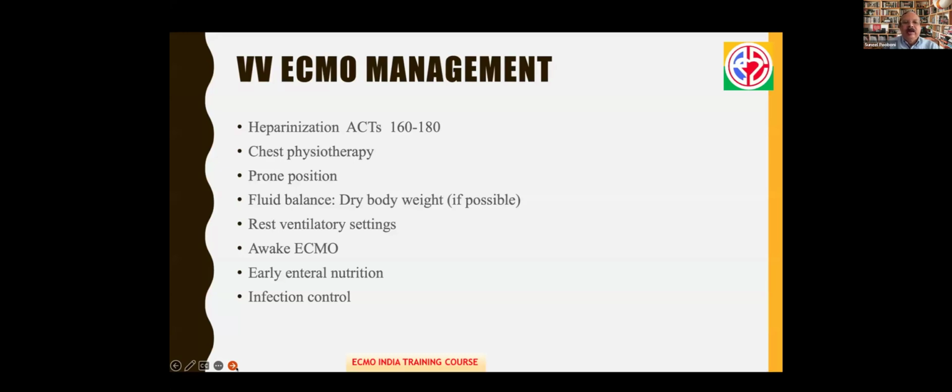I know about the recent trial in adults which shows prone position is not very helpful, but it is still debated at this point of time. We were in a meeting very recently with Dr. Gattinoni, and he used to say this is a very heterogeneous population. You cannot compare the subjects who will benefit from prone position to those who don't get better with prone position. So it is still debatable.